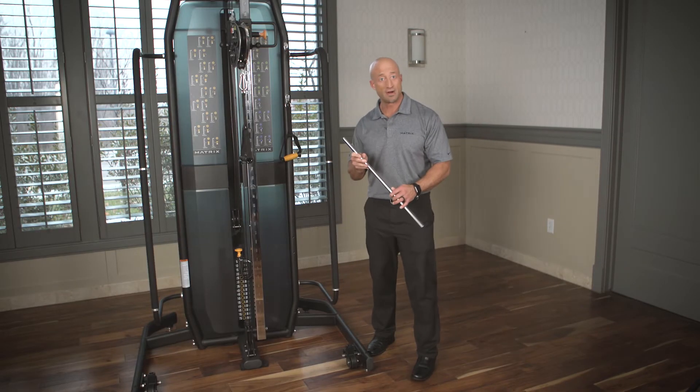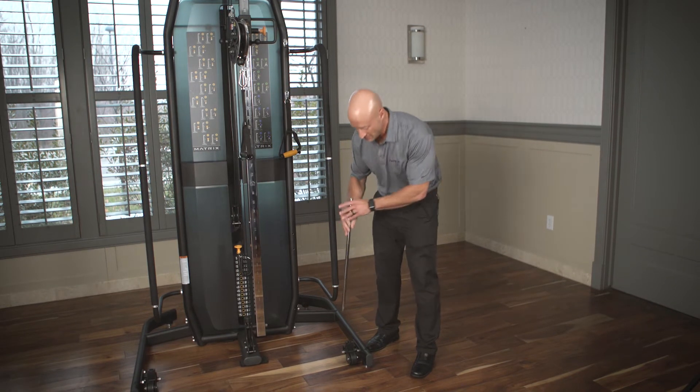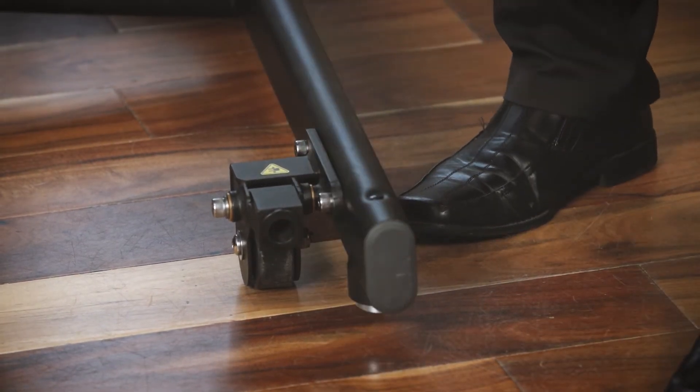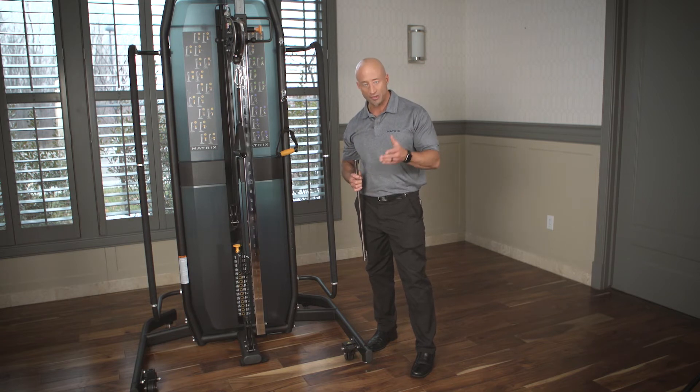Stored behind the machine is the rod that allows you to engage the wheel, and it's very simple to engage and use. Right at the top, it goes in here and it pivots forward. That wheel is now on the ground lifting the machine. You do that in two other positions and it's completely portable.